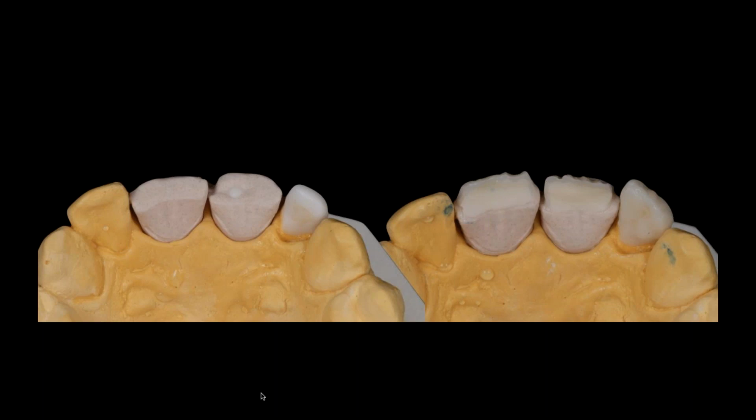So I actually modified the material by putting some fluorescence in it. I put a little bit of a very fluorescent stain in there, and I mixed it in with the powder and then built up that little core. Why?